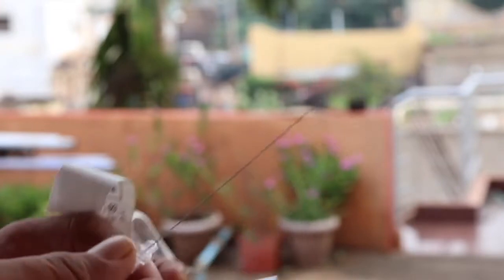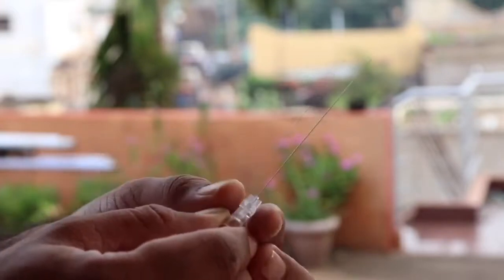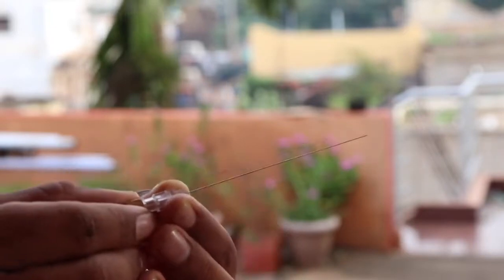There are three types of needle tips: Quincke, Whitacre, and Sprotte. This is the Quincke type of needle tip.